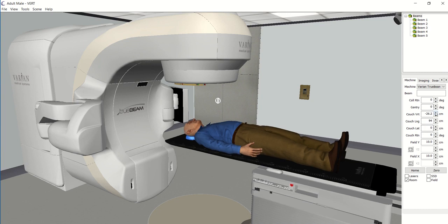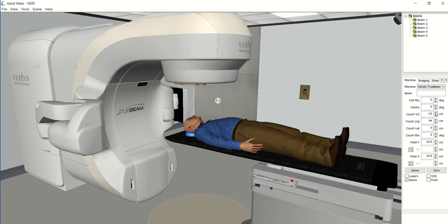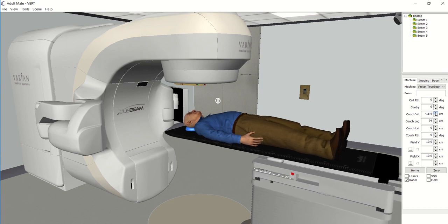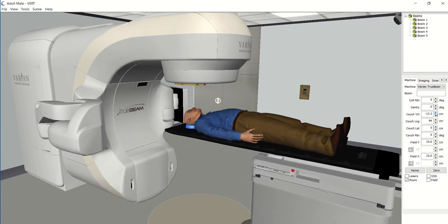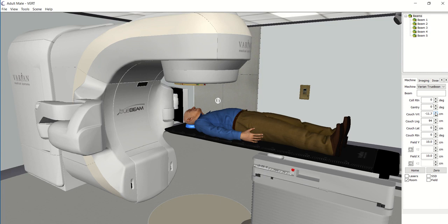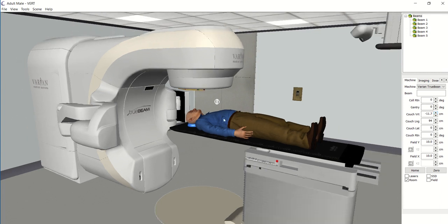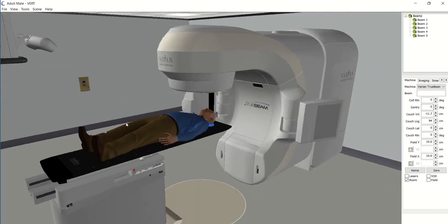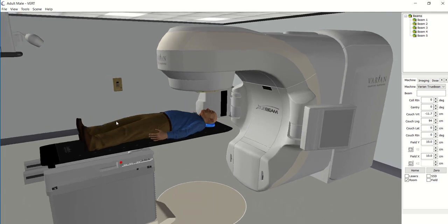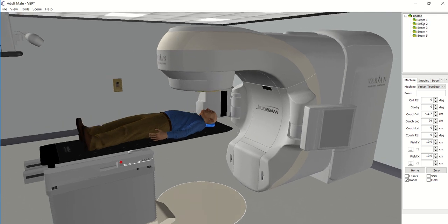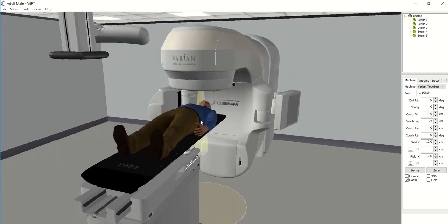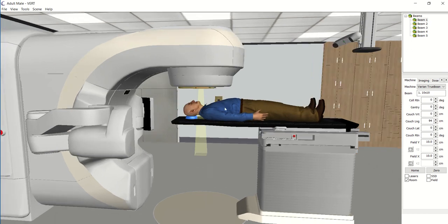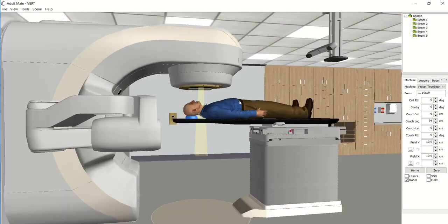We'd bring them right up close to the machine. The beauty of using this software first is that we can't actually harm the patient — so if we go too high and crash them into the machine, it's best to do it now. We can also add the beams on with this software, so we can actually see where the radiation would be hitting.